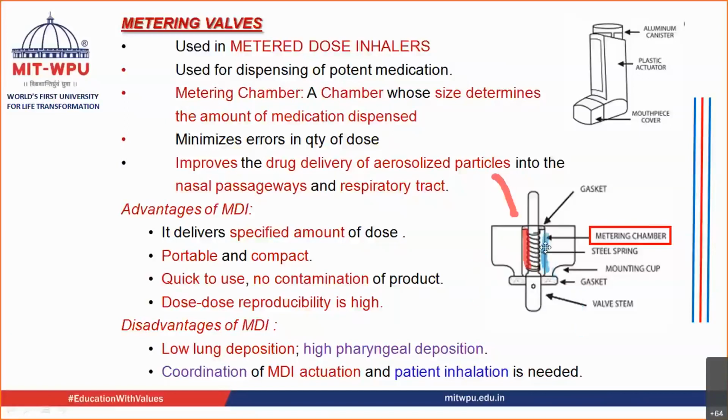When you press it again, when it is actuated, again these contents come out and go inside the patient, and this process is repeated.